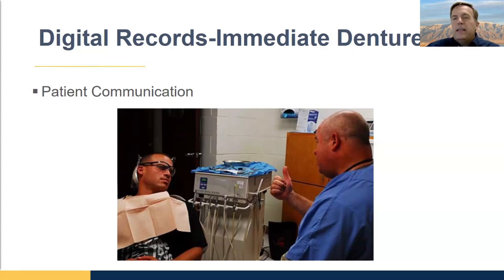The second thing is you need to decide how you want to do your immediate dentures. You can either do an economy denture that you deliver on the day of surgery and then use a reference denture workflow to make the final, or you can deliver the final denture and plan on doing a reline later. I would recommend the 2-denture approach, because most of the time in the laboratory, when we do an extraction, we do what I call a lab extraction, which is basically trim the model, the surface scan, at the necks of the teeth.